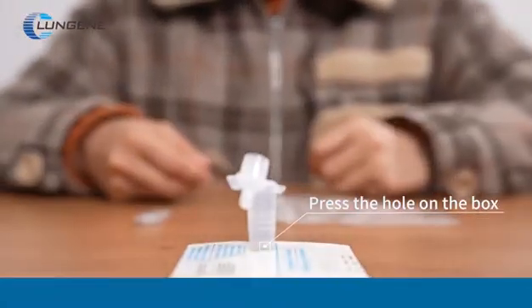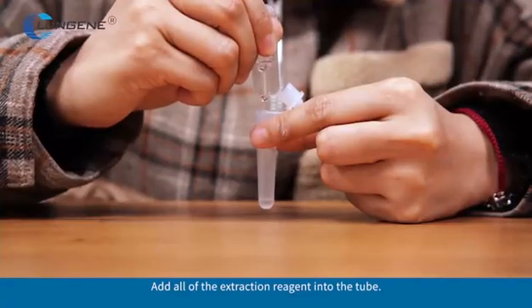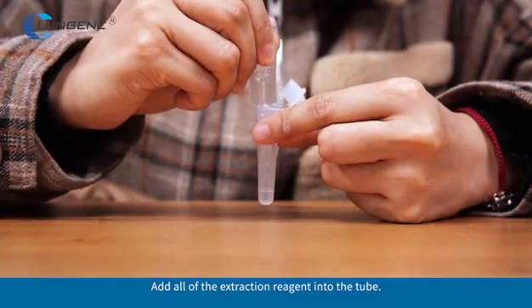Insert the tube into the hole. Unscrew the lid of the extraction reagent and add all of the extraction reagent into the tube.